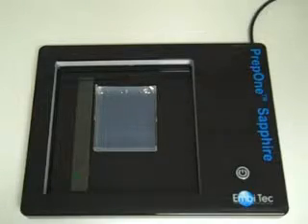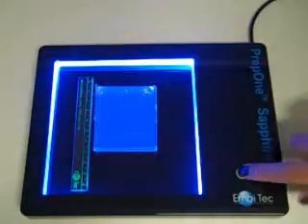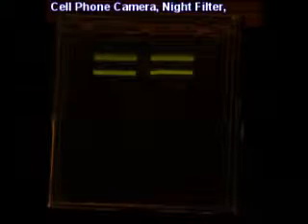For better pictures, use a light controlled environment. Turn on the unit, place the night filter on, then the hood. Aim your cell phone camera and snap. Here's our picture.